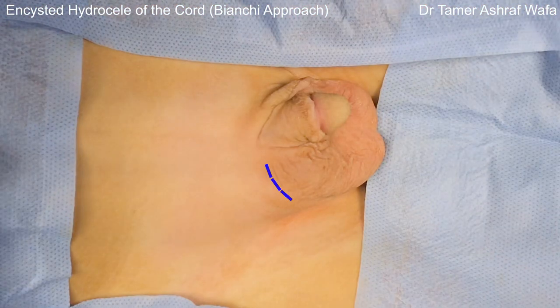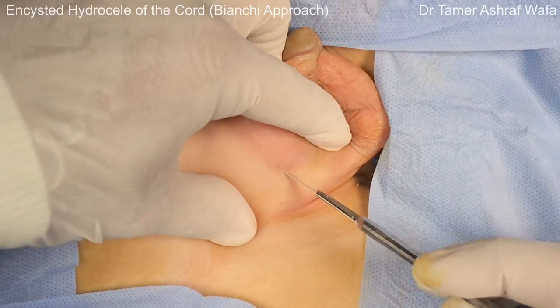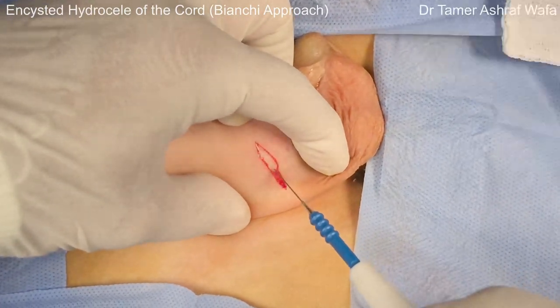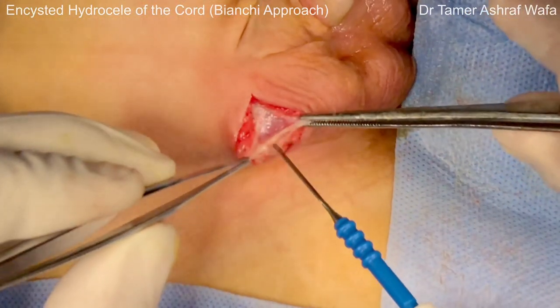A curvilinear incision is placed in a skin crease between the scrotal and inguinal skin. The superficial fascia and dartos fascia are incised using monopolar diathermy, exposing the spermatic cord.